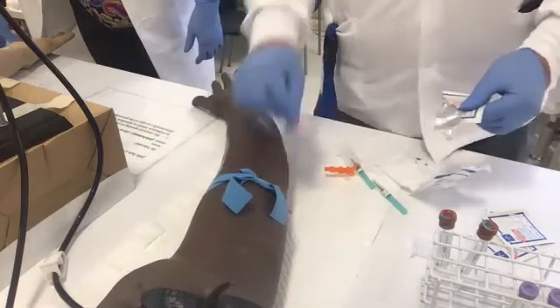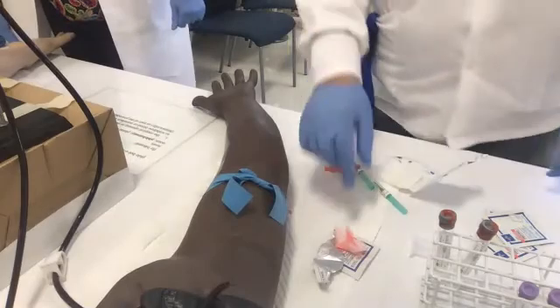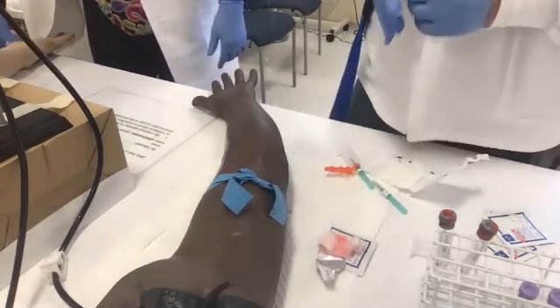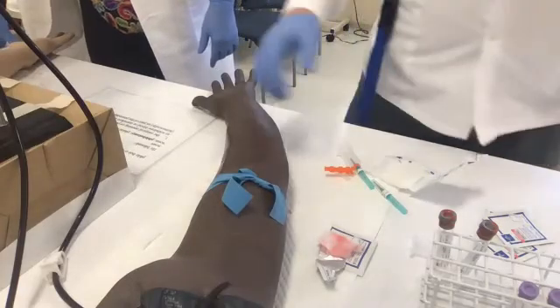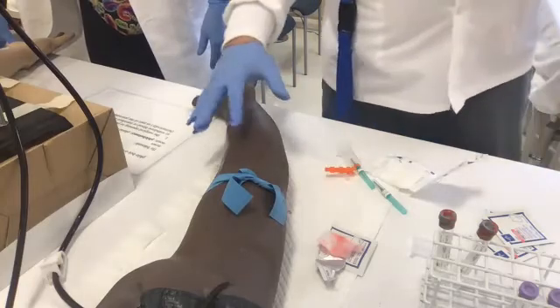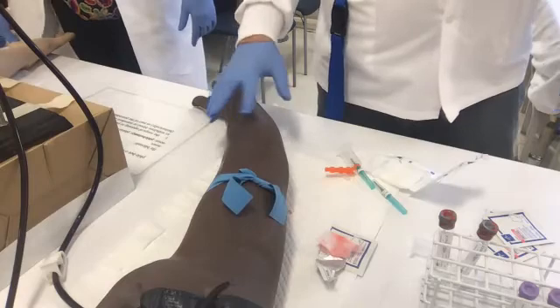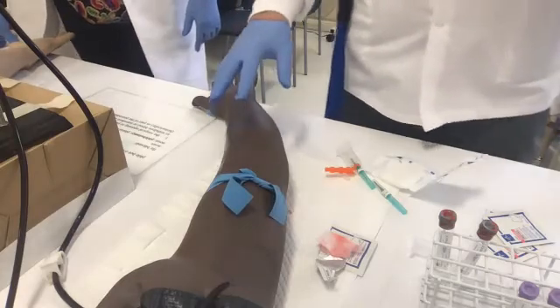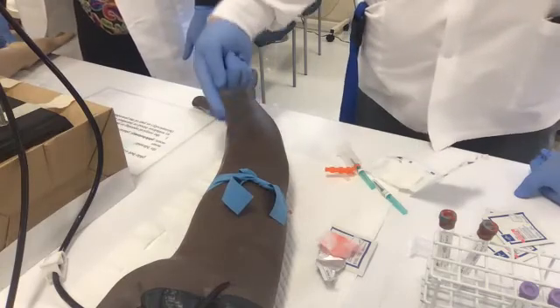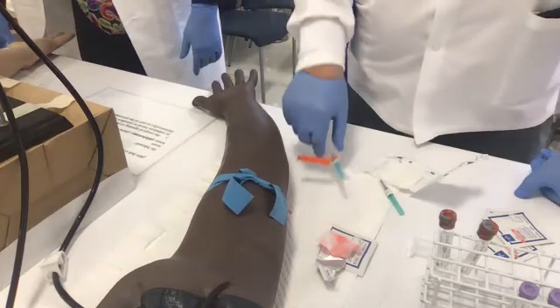It gets bigger, bigger, bigger, and then I put that down. Now I put this here because I'm going to need that in a minute, and I'll show you why. So now I assemble all my equipment, I small talk, right? Because remember what we mentioned earlier today, I can't stick because this is still wet. You see how it's a little bit shiny? So I don't want to cause hemolysis, because if I stick my needle and this alcohol goes inside this needle, it's going to go inside the tube and then we're going to have a problem.